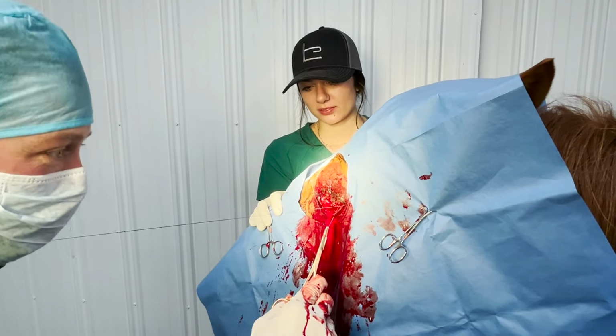We'll put the eye saver on over this too. We have a mask called an eye saver we use for various things. It basically has a big hard cup on the affected eye, so if she accidentally bumps it or rubs it, it protects everything. She probably had one of these as they were treating the eye at various stages too, so she'll be used to it.